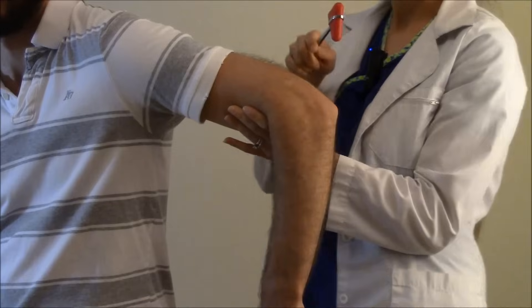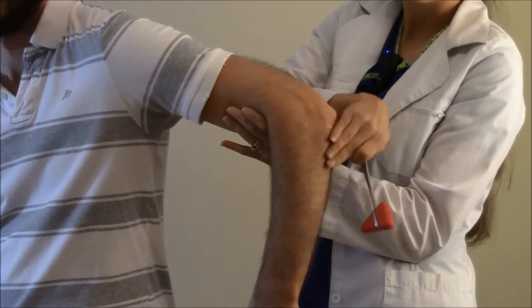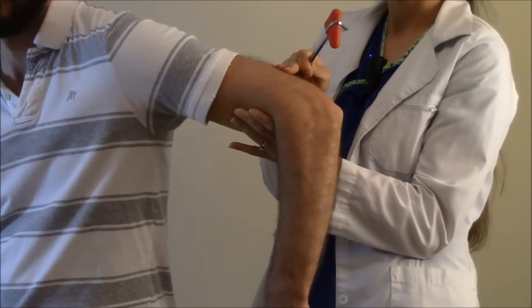What we're going to do is take the hammer and just briskly hit on that deep tendon, and what you'll see is extension of the forearm and a slight contraction of the tricep.